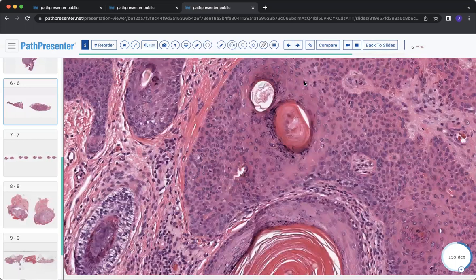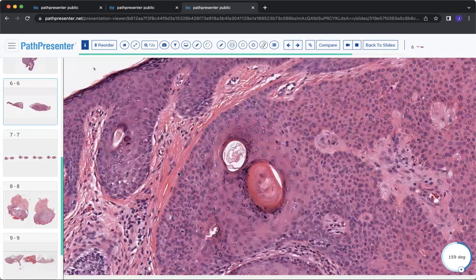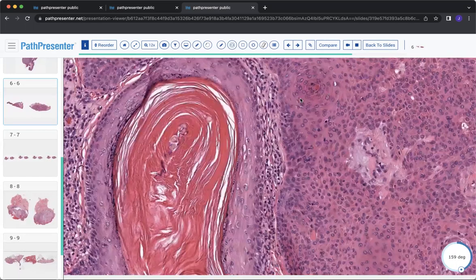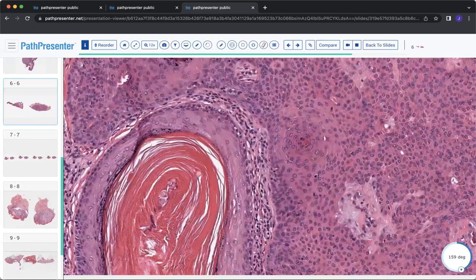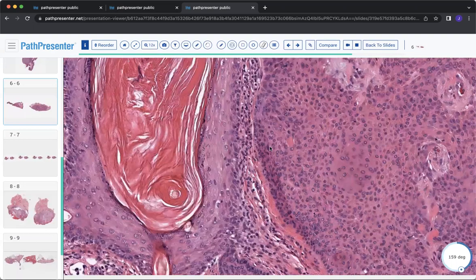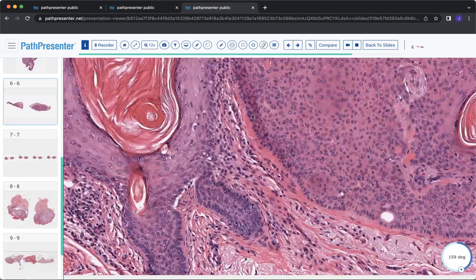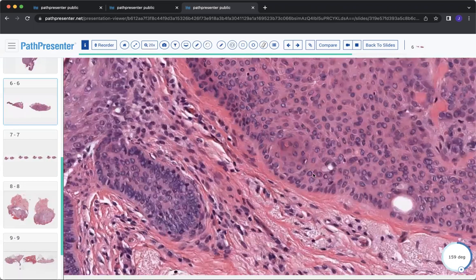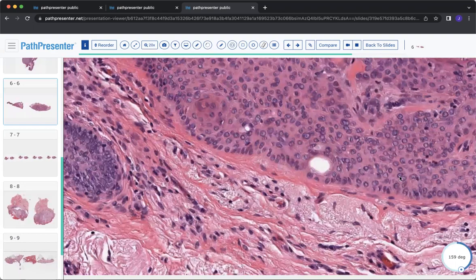Usually in a trichoepithelioma, you won't find these large areas of organized palisading, which is what we have here in this trichilemmoma. Now you can have inflammation within a trichilemmoma as well, which may make it hard to appreciate the eosinophilic rim. But as you get out here into these other uninvolved areas, you can see that a little bit easier.